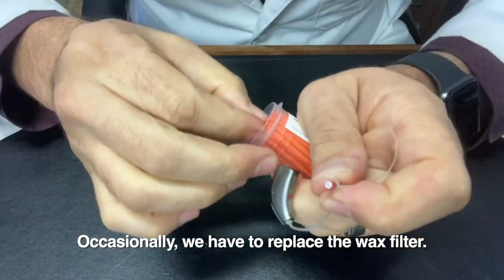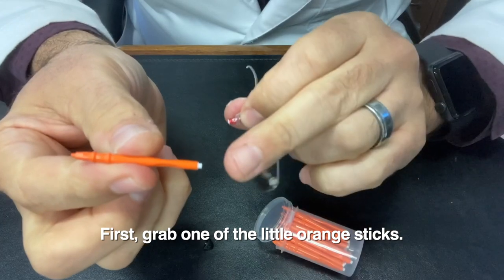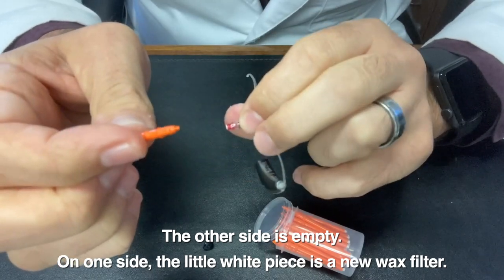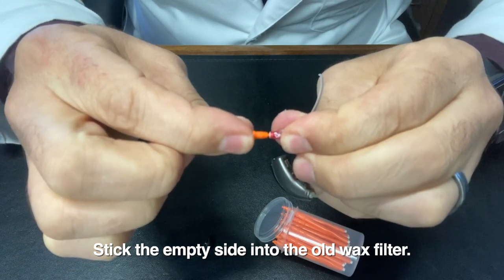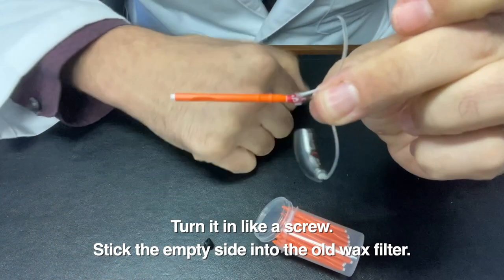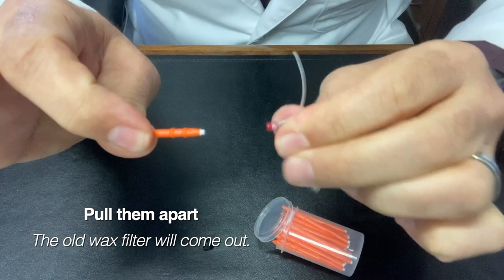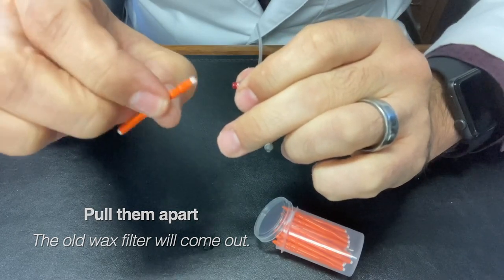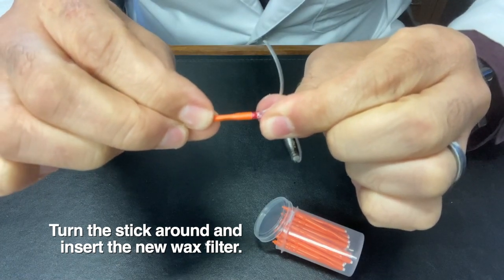The way that we do that — there are these little orange sticks. You take one of these orange sticks, and you notice that on one side there's a little white piece, that is a new wax filter, yet on the other side it's empty. So we're going to take that empty side and stick it directly into the end of the device. You can actually turn it in like a screw, and if you've done it correctly, it'll stick right in there. Go ahead and pull that out, pull them apart, and see — it took that wax filter with it. This is the old wax filter. So what you want to do is turn this around and put the new wax filter directly in there, and release.